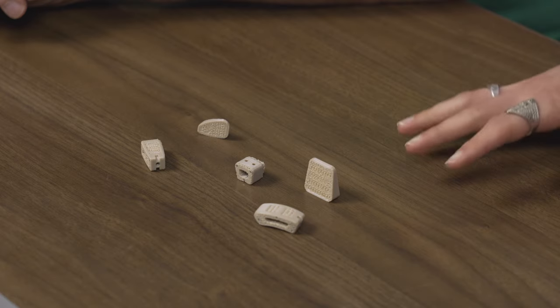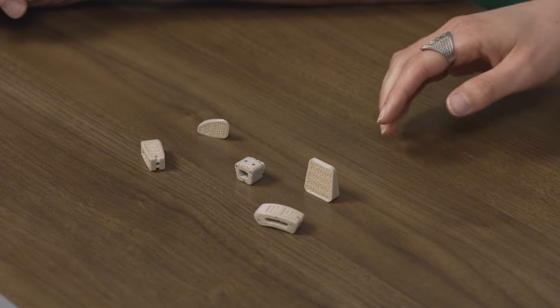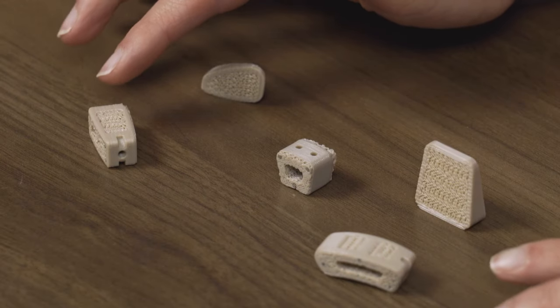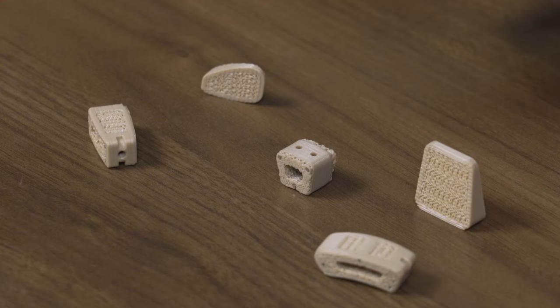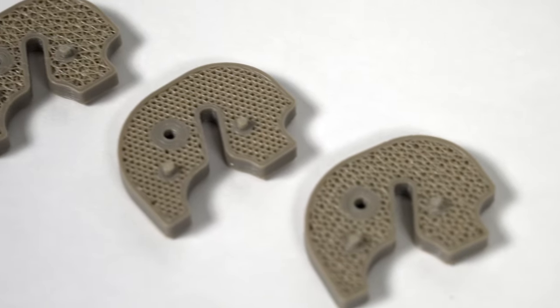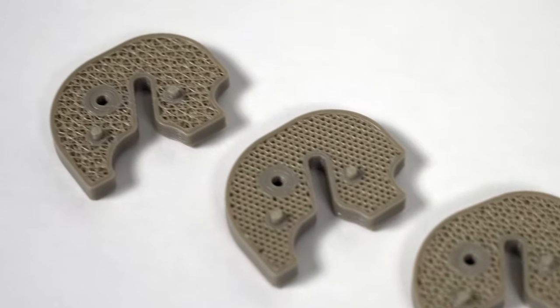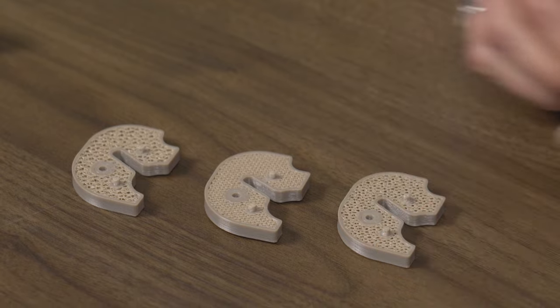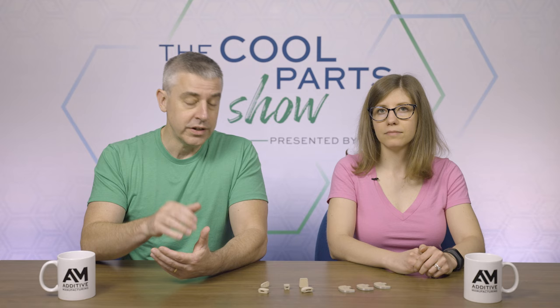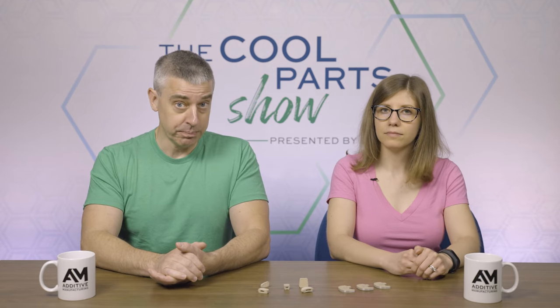So we have some other examples of things that they're working on. These are different types of spine cages for lower lumbar conditions, wedges for foot and ankle surgeries. They're even playing around with some different types of infill patterns, like you can see in these tibial spacers. And as implants like these become available, become approved, Curiteva will be ready to produce them.